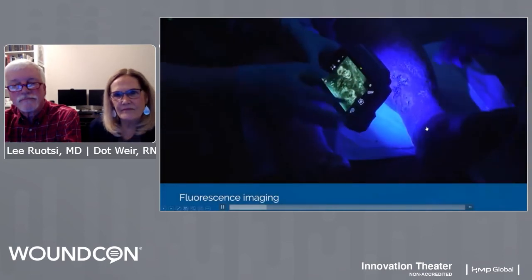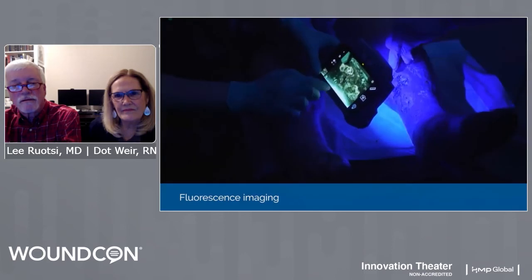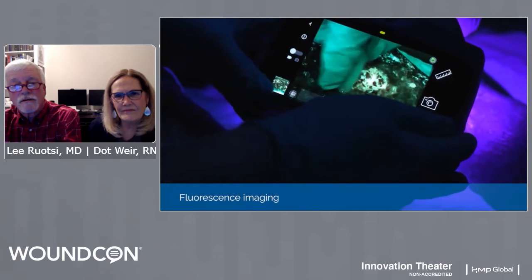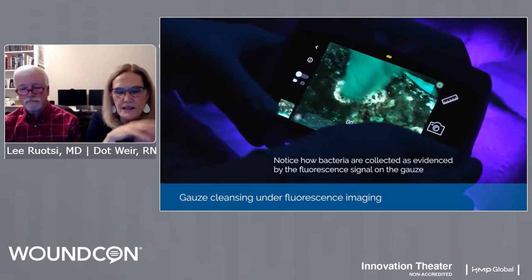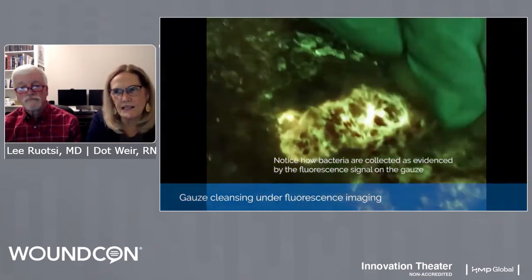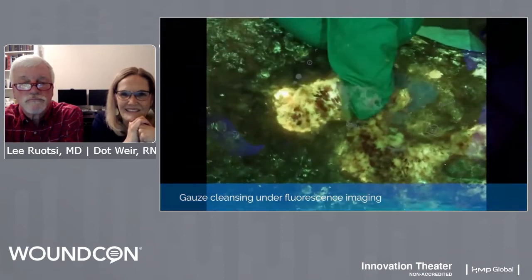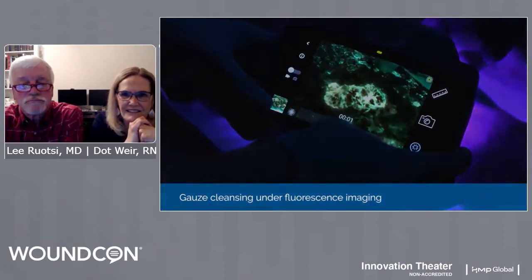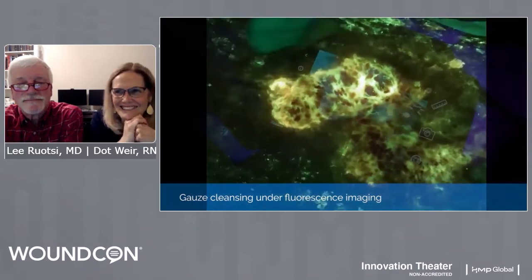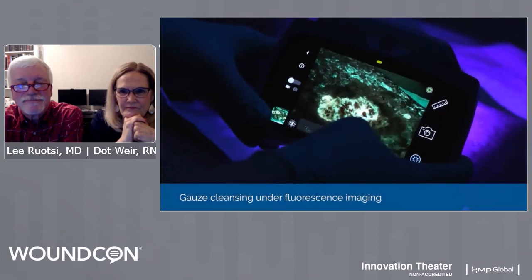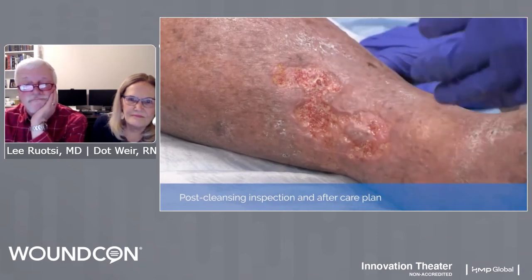What's really lighting up is the wound bed right in this area. You can't really appreciate how much force we're using — it doesn't take a lot of scrubbing. One important thing: if it hurts to clean, no one is going to clean. So use lidocaine jelly liberally. Now we see a lot of brightness almost exactly at the wound edge. It pays to get new gauze every time you wipe. Generally we try to break up fibrin through enzymatic debridement. But now that I know there's so much bacteria there, I'm going to start recommending something different — something to get rid of the bacteria and also to address this yellow fibrous tissue.